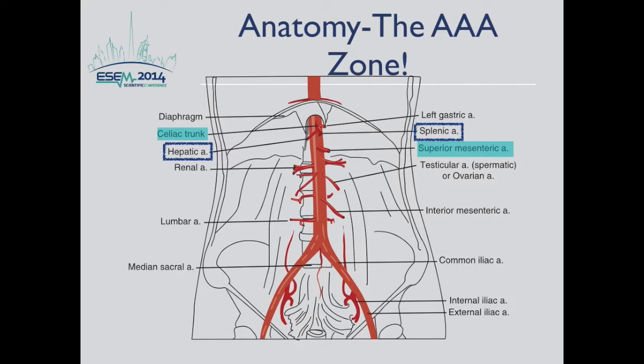While the renal arteries may be visualized, the branches of the gonadal and inferior mesenteric arteries are not typically seen with ultrasound. The abdominal aorta ultimately bifurcates into the common iliac vessels around the level of the umbilicus. The normal abdominal aorta has a proximal to distal taper, and the loss of that taper with a diameter greater than 3 cm indicates the presence of an aneurysm. An iliac diameter of greater than 1.5 cm is indicative of an iliac aneurysm.